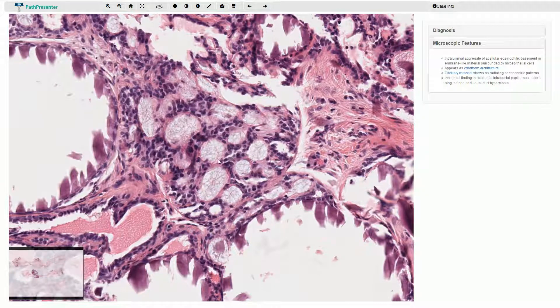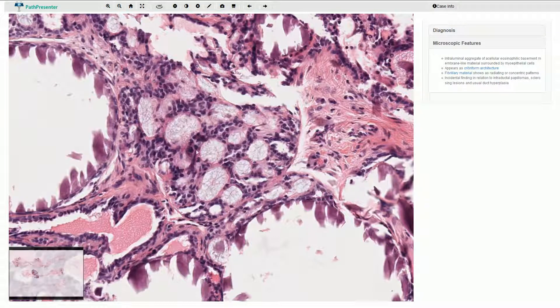It is very important to pay attention to these myoepithelial cells. They are not monoclonal as in ductal carcinoma in situ and therefore they are not so uniform. We shouldn't see a palisading of these cells around the luminal structures as in ductal carcinoma in situ.